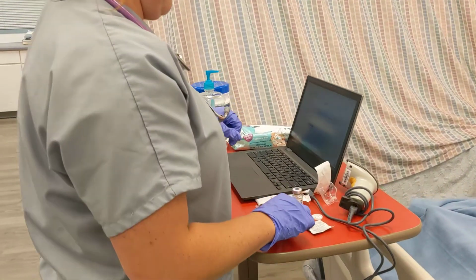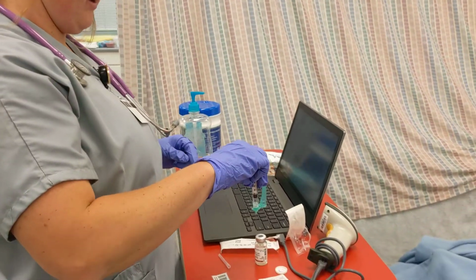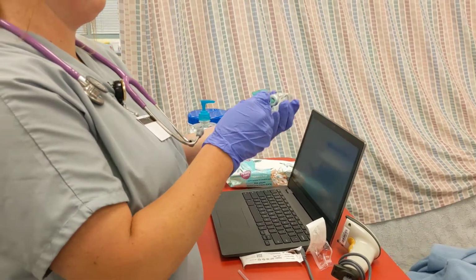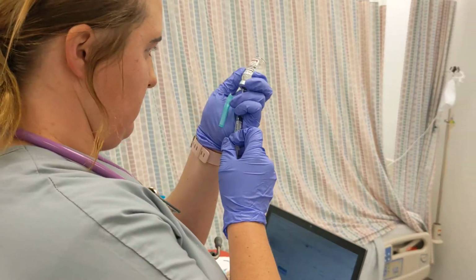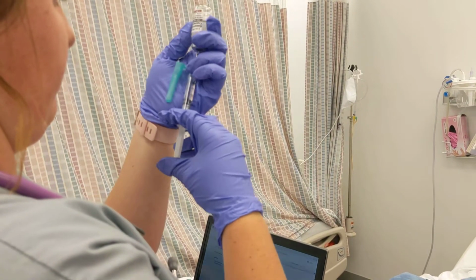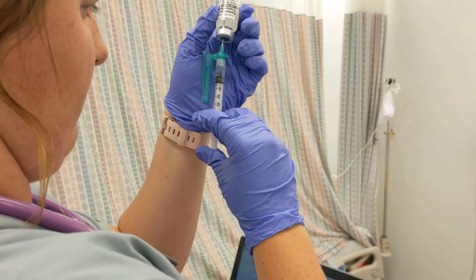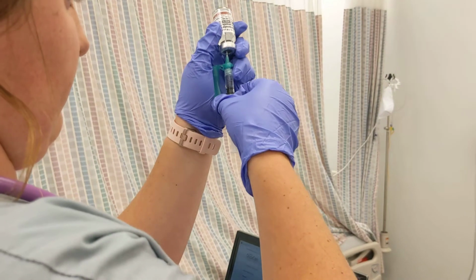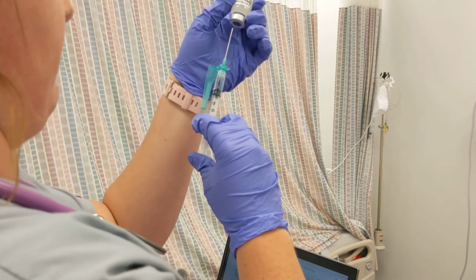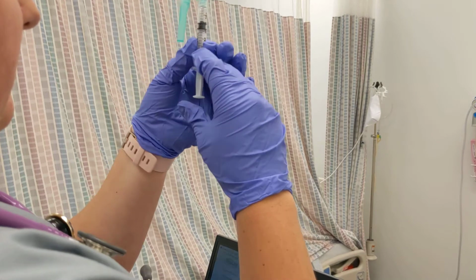Okay, so I'm going to drop the medication now. We'll just drop that off. We've got 1 milliliter of air. I'm going to push that in. All right, now we're going to draw up our medication. Okay, so 1 milliliter of air.